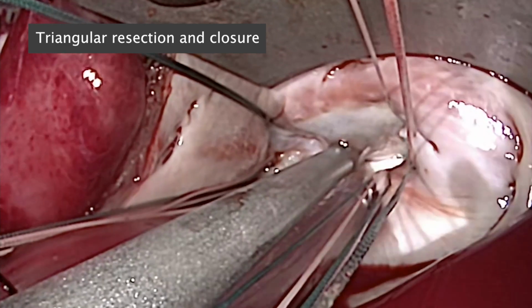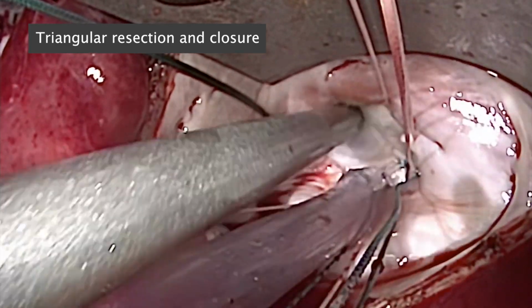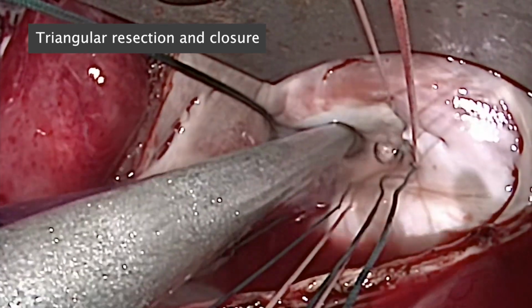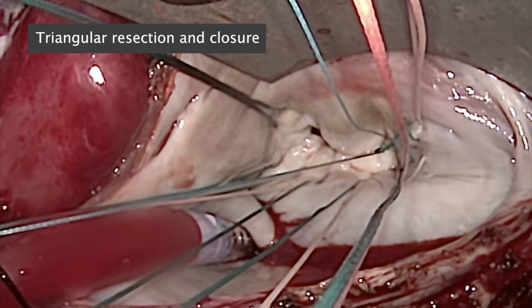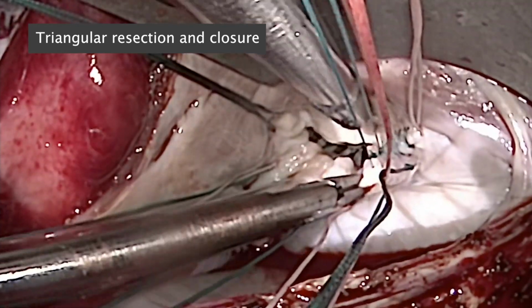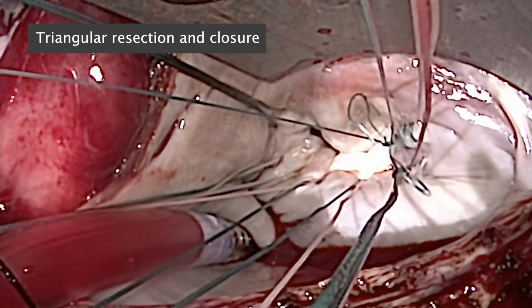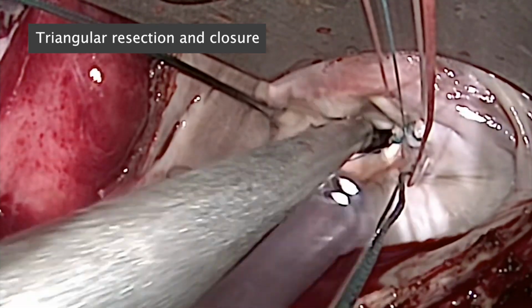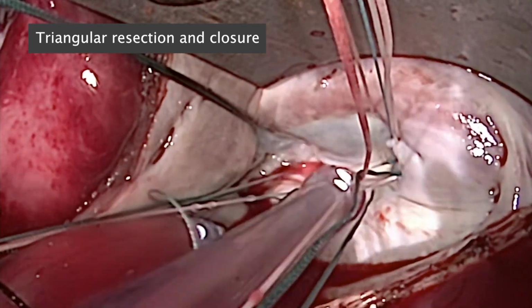Repeat valve testing already is showing that the AP diameter is different along the size of the valve, but you can see that there is a residual leak medially. We do place an additional suture, an additional 4-0 Ethibond, to advance the commissure to try to help with this. Repeat valve testing is done and shows that the residual leak has improved.